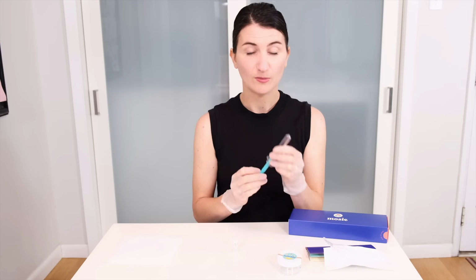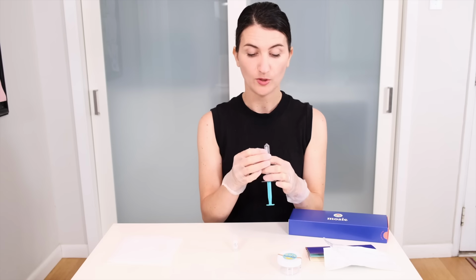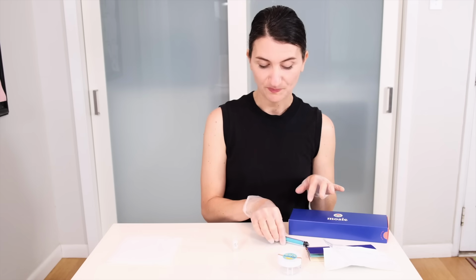Mosie obviously is a little bit different. It doesn't have a barrel at the tip and it's got a slit opening, so you want to take a peek at that because as you go to suck it up, you'll want to think that through too. When you're ready and you're comfortable, give it one final big push. Have all the air out of that top. Set it aside for now.